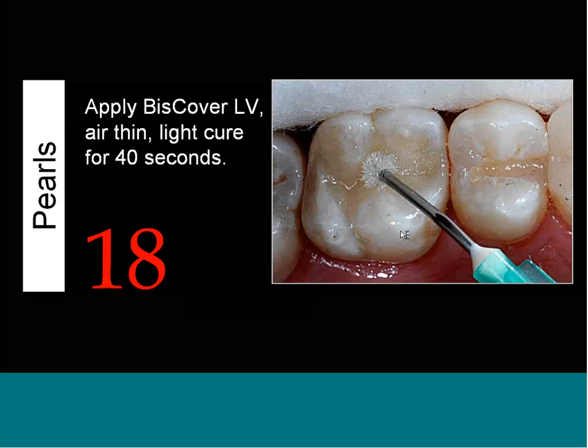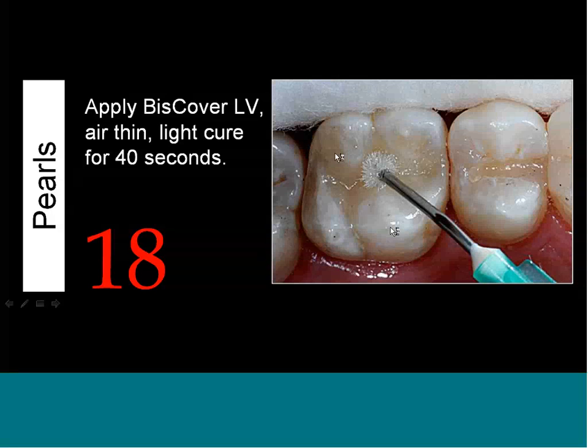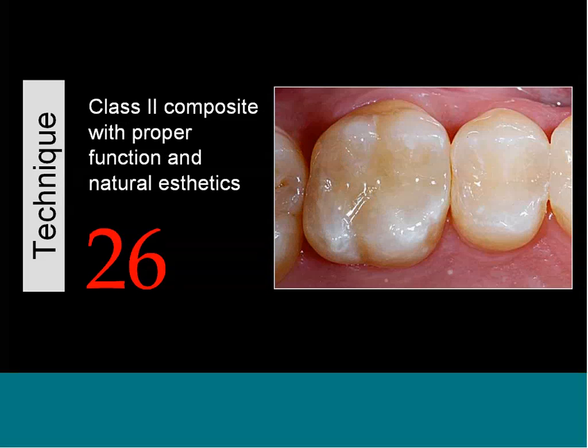This is a little older slide. There's a brush that comes with the Biscover LV, the little blue and white brushes. So you apply that and light cure it for 40 seconds. And those are the restorations after. So they have a nice shine, but more important, they're well sealed all the way from the enamel to the restoration, and then the restoration itself is sealed of the little microfractures.